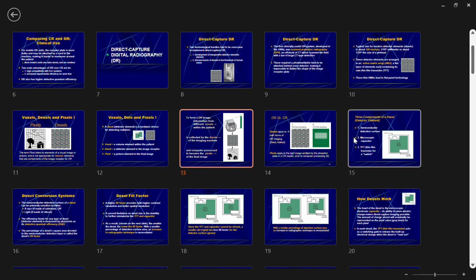light into electricity, okay? That's what detector cells do. Detector cells are conversion devices. They're detecting X-ray light, converting that into an amount of electricity, and then sending that to the computer. And the computer reads electric current, okay? So we have to learn what our detector cells are made of, and how they go about doing this conversion. Conversion is going to be the big idea here: how we take and convert X-ray light into electricity.